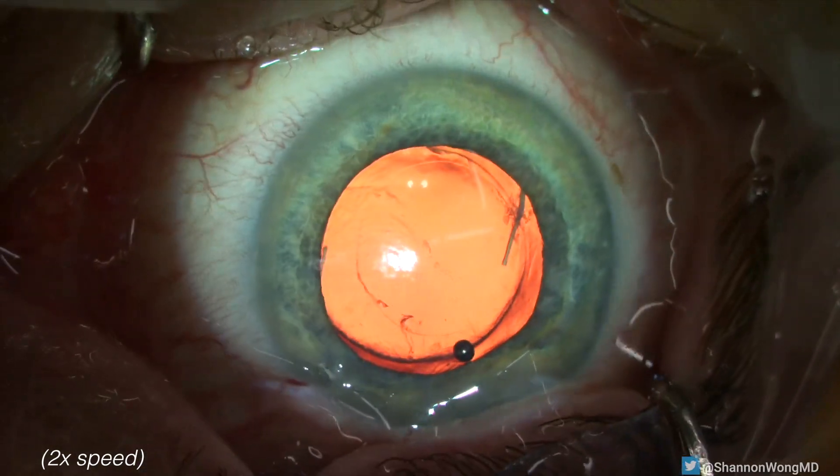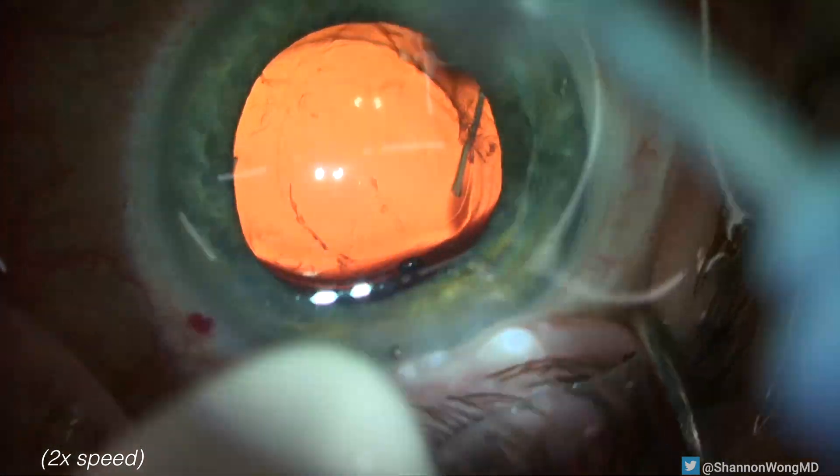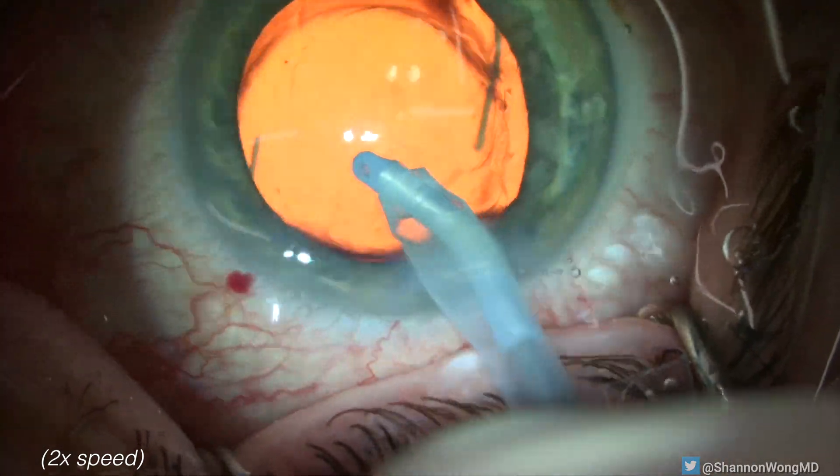we are always anticipating the possibility of this complication occurring. Because we identified the problem immediately, the patient had a normal, routine, uncomplicated result.